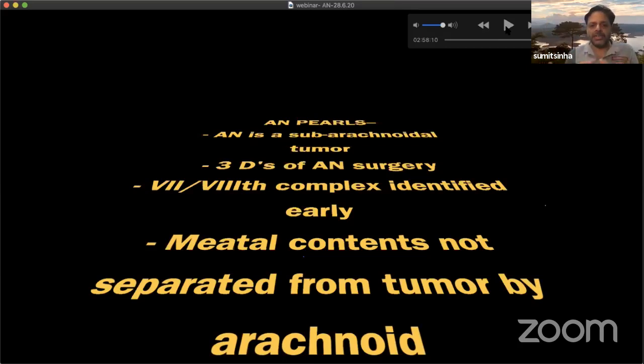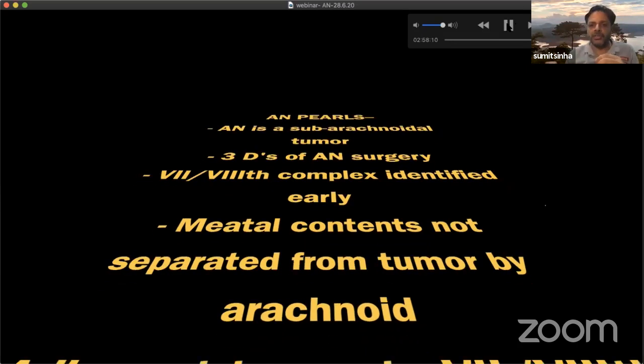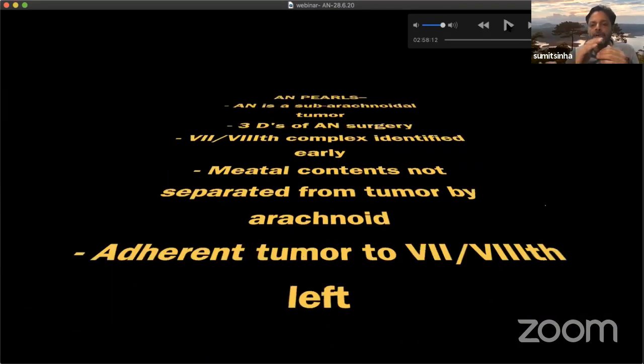The meatal contents are not separated from the tumor by the arachnoid. As you have seen in the video as well, there is no arachnoid which separates the seventh-eighth complex from the tumor tissue. Therefore, it is imperative to carefully preserve this important complex while you are dissecting it from the tumor tissue.